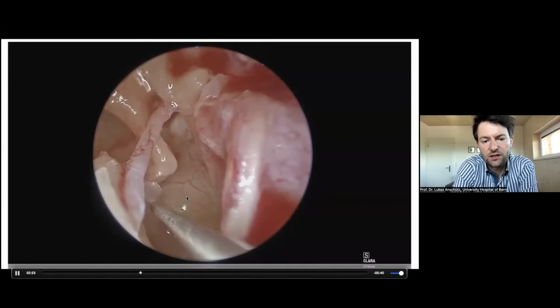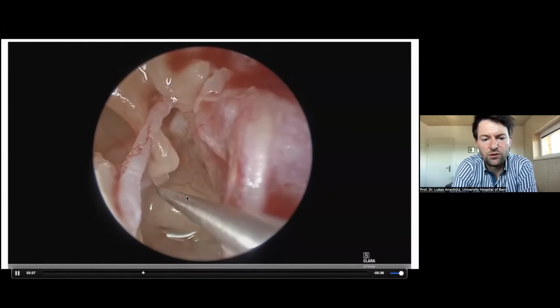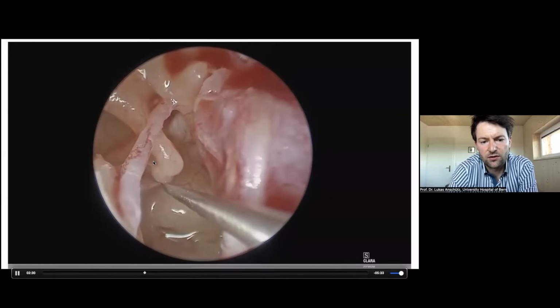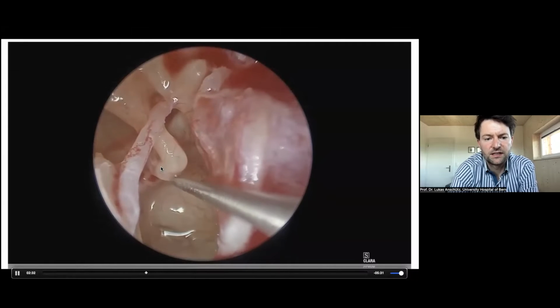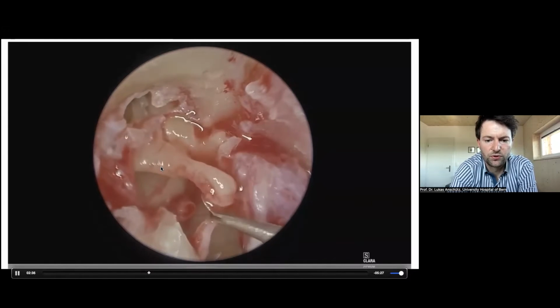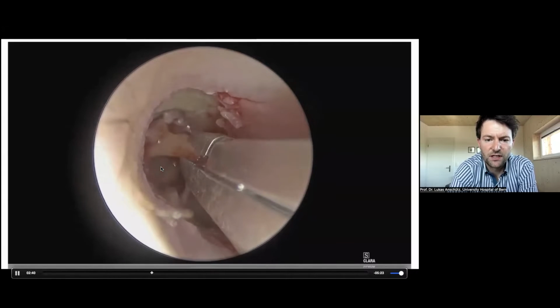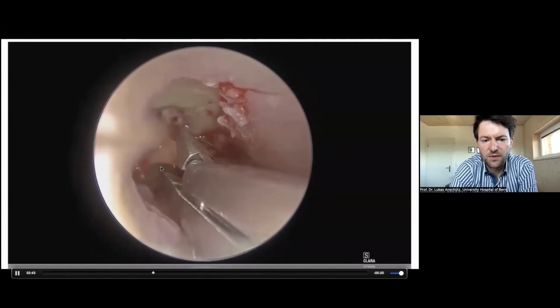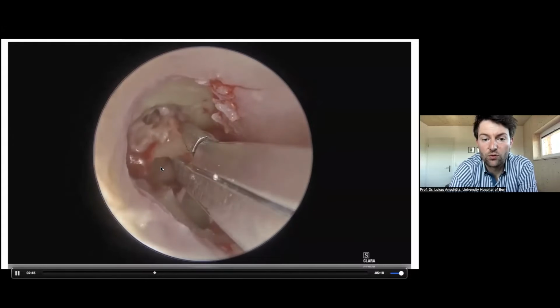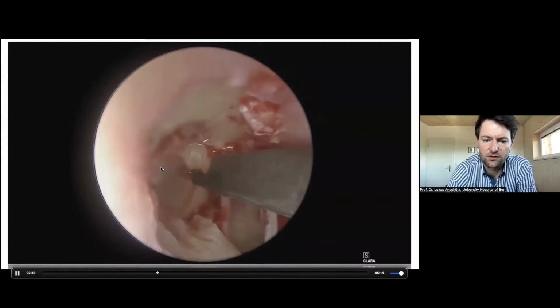It would not be turned in as when you use the drill. Now I can cut the incudostapedial joint. You can see I do it with a round knife. Here is the lenticular process, and I can luxate the incus. I put the chorda downways, and now I can remove the incus because I know the incus is in the middle of the cholesteatoma and I need to go more posterior, so I cannot leave it inside. You can see also it's quite eroded.